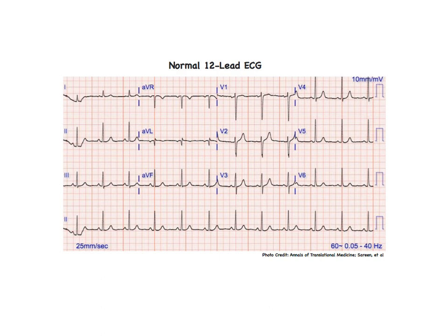but if you were to record a 12-lead EKG on someone in the emergency room who presented with chest pain, you would realize that not all the QRS complexes look the same across the sheet. When you couple all the depolarization and repolarization events throughout the cardiac cycle and take cutaneous electrodes to trace the activity between 2 points outside of the cell, you get the readout printed on the EKG machine that you see before you. All of these different leads are essentially different viewpoints of the same heartbeats.